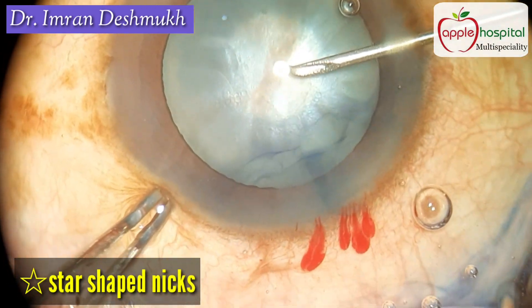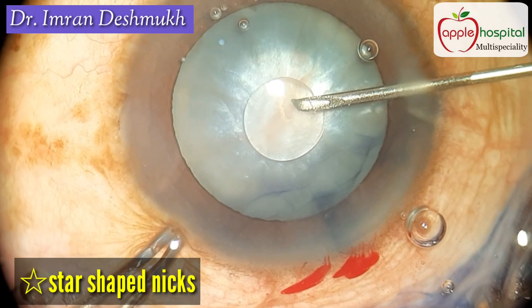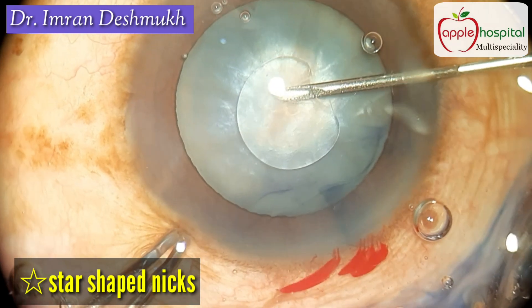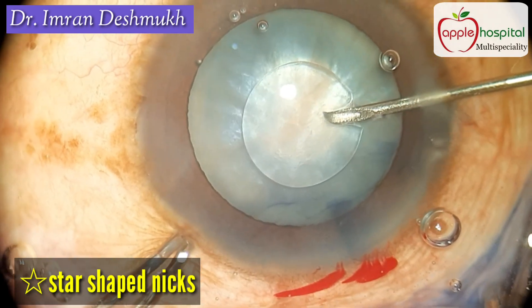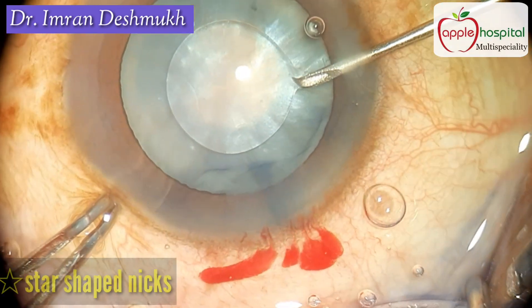I enter through the sideport. I use my cystitome and make star-shaped nicks or incisions on the anterior capsule. I make these nicks in all possible directions, and as you can see, there is a gush of fluid coming out through the opening in the anterior capsule.